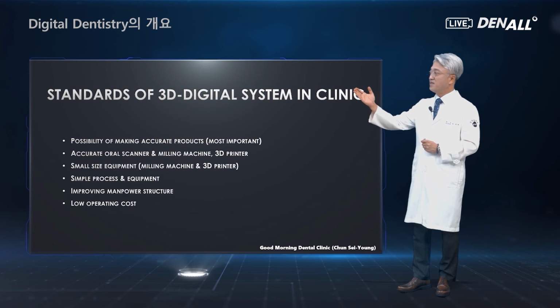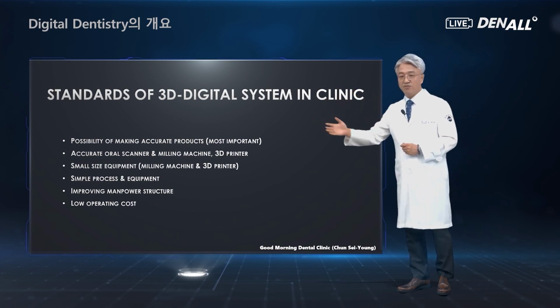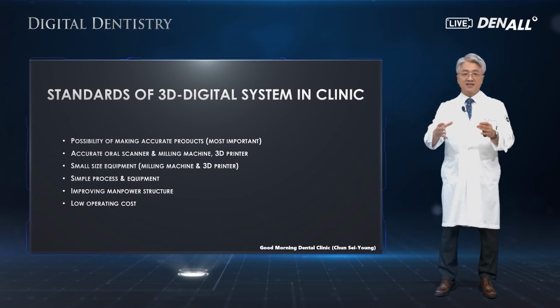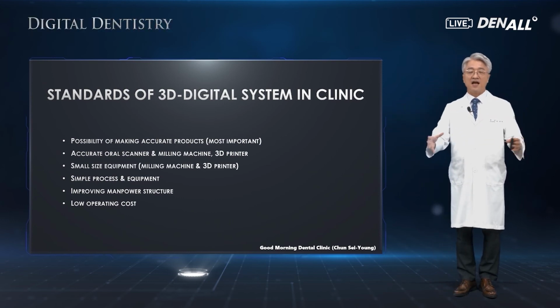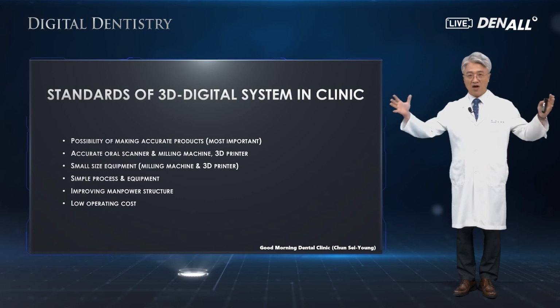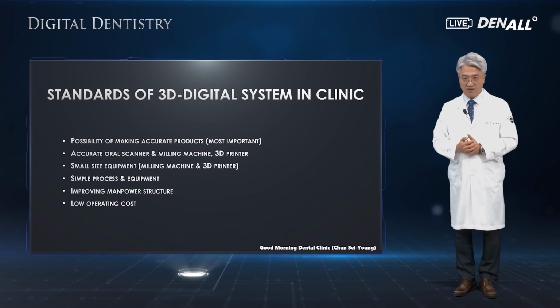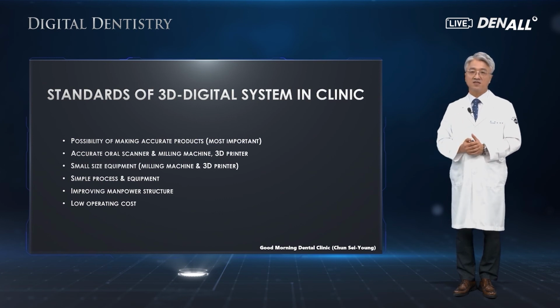Milling machine or 3D printer or intraoral scanners size should be reasonable so that they can be operated in a dental office. If it is too big or too slow in speed, it's not good for in-clinic situation.